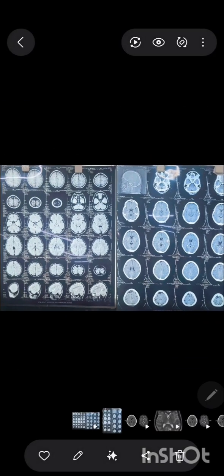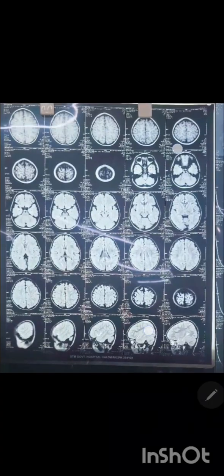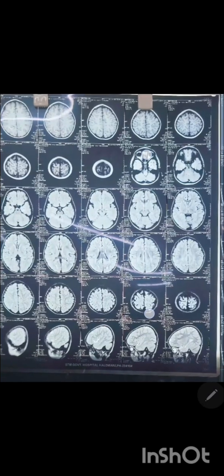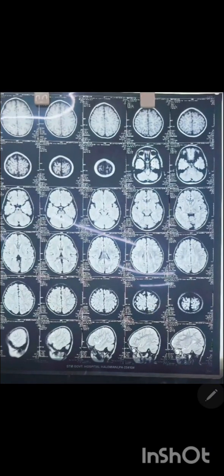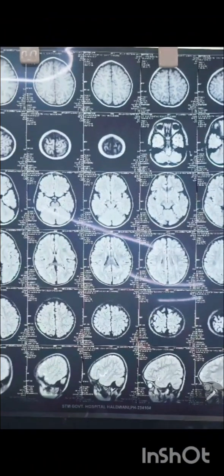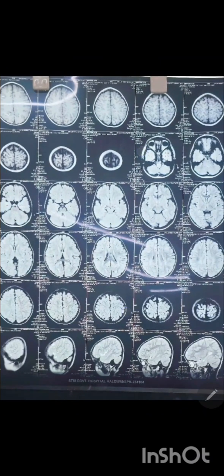And doctors rely on MRI for evaluating sports injuries, diagnosing neurological conditions like multiple sclerosis or tumors inside any part of the brain tissue, and seeing the spinal cord or soft tissue if there is any damage inside.